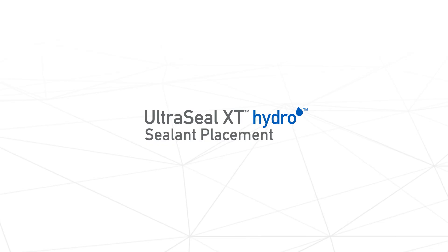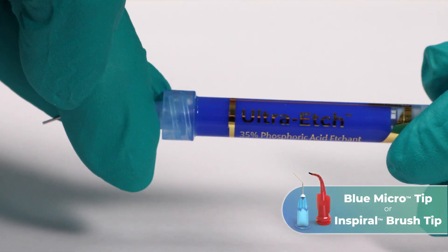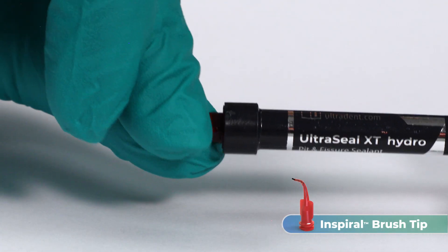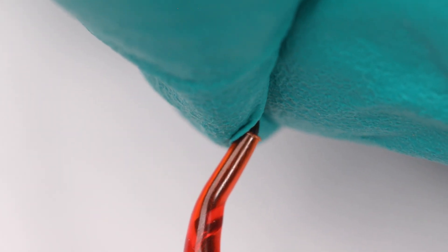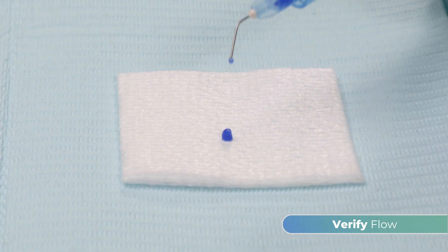To prepare UltraSeal XT Hydro Sealant for placement, attach an Inspiral brush tip or blue microtip to an Ultra-etch 35% etchant syringe. Attach an Inspiral brush tip to an UltraSeal XT Hydro Sealant syringe. If needed, adjust the bristle length by grasping them and moving them in or out. Verify the flow of all syringes prior to using them intraorally.